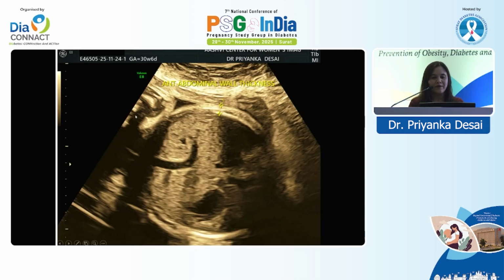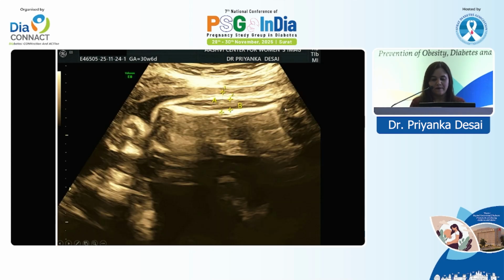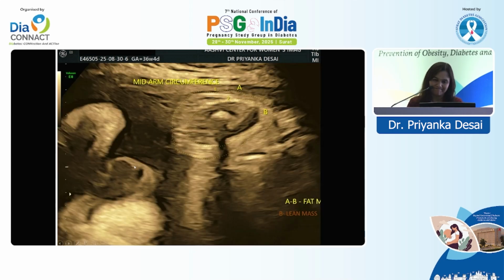So this is how we measure the anterior abdominal fat thickness. This is the image which is showing the scapula of a fetus. This is a 36-weeker, and this is how we measure the subscapular fat thickness. So these are the cheeks of the fetus, and this is how we take the cheek-to-cheek diameter.